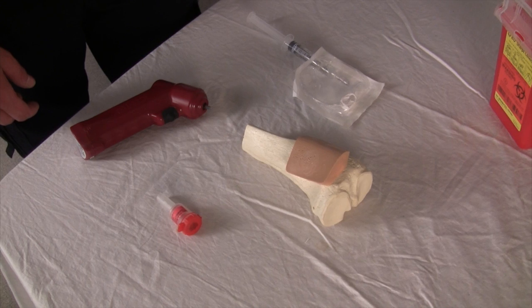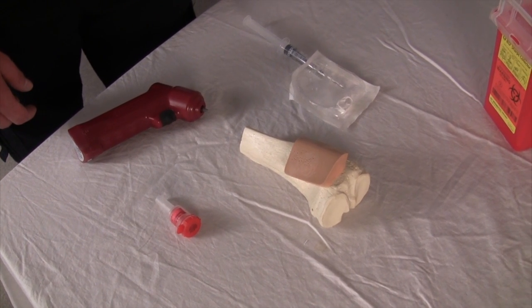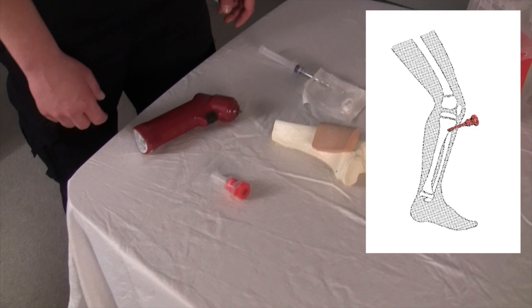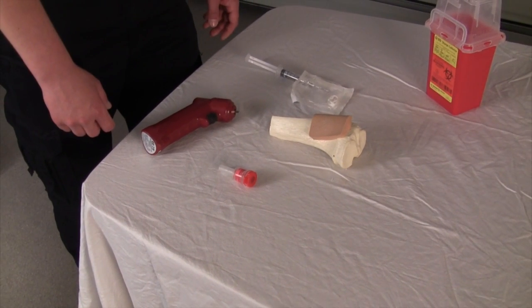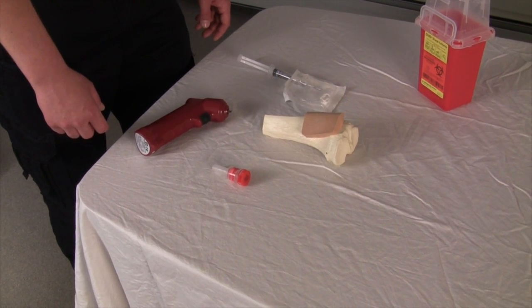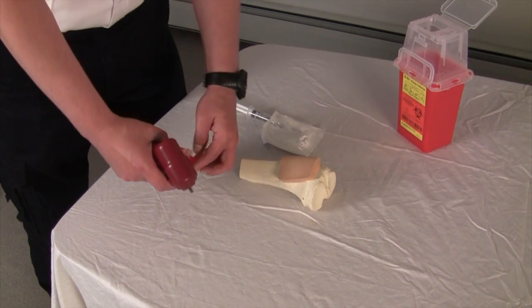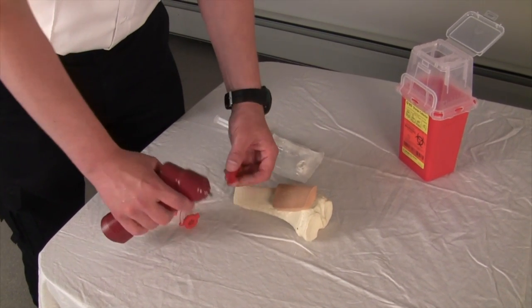The most common place to put it is two finger breaths distal to the tibial tuberosity on the medial side of the leg, where it's very shallow. There are two parts of the system: one is a drill, and one is the needle. The needle is metal and the drill is magnetic, so it holds it in place.